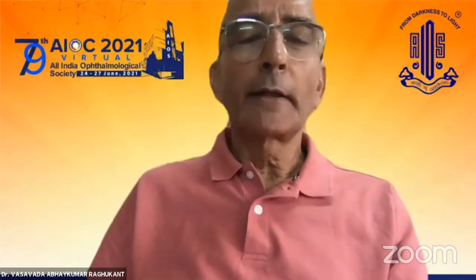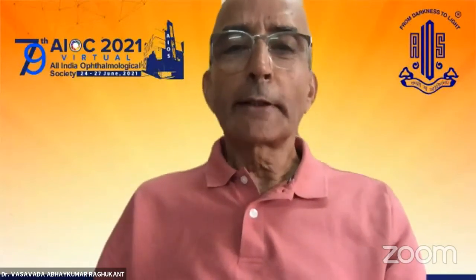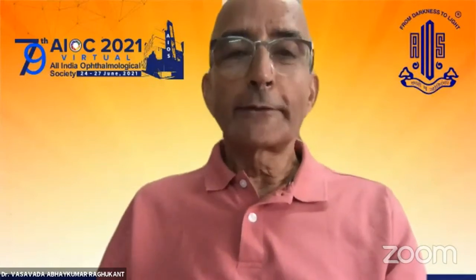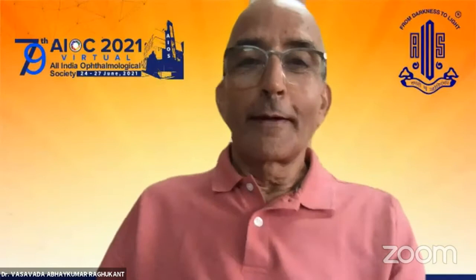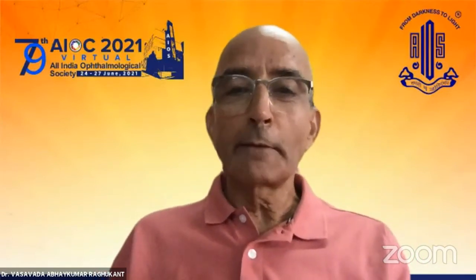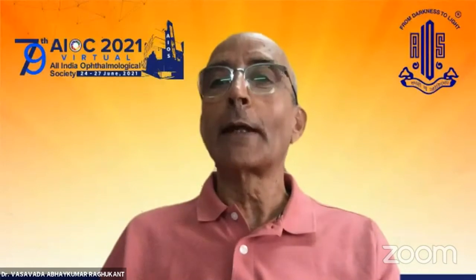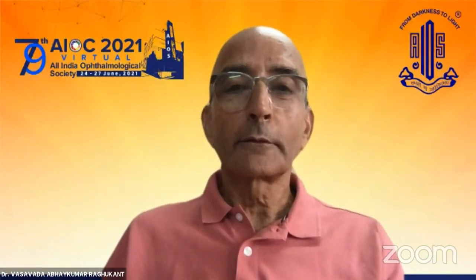And what I learned from Dr. Ramamurthy many years ago is that astigmatic defocus is more degrading than the equivalent spherical defocus. So astigmatism is the name of the game, whatever you're doing, multifocal or whatever. Astigmatism correction should be a routine. Toric IOL, I think, should be a default for everything, as Dr. Ramamurthy highlighted very well. So thank you.